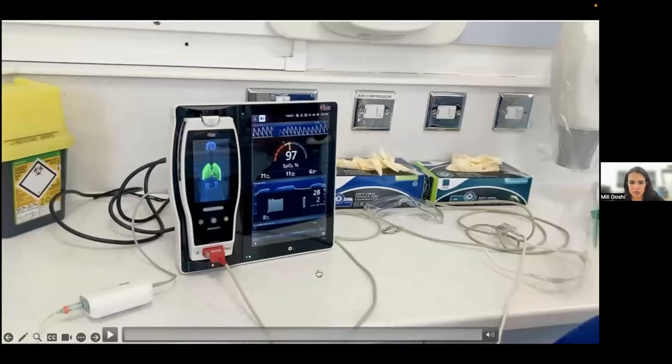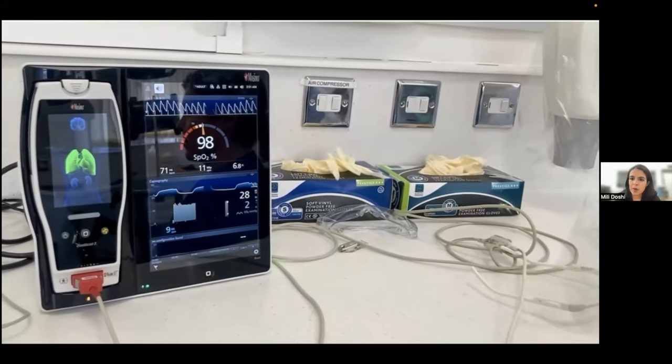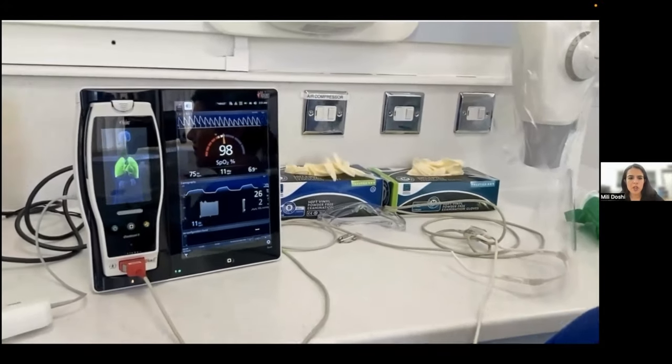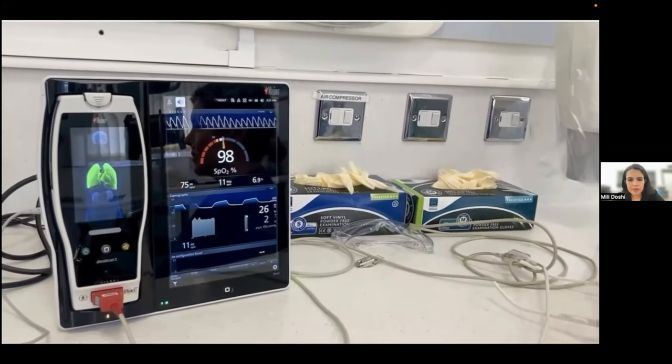So I'm just going to share now. I'm just going to check. Yeah, I've got a video with you. This is a video I took with my dental nurse Louise of her breathing. She's got the mouth piece, but she's breathing through her nose. Thank you, Louise. Can I ask you to now breathe really fast?